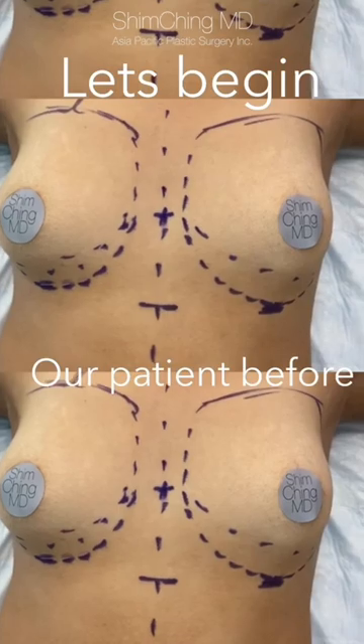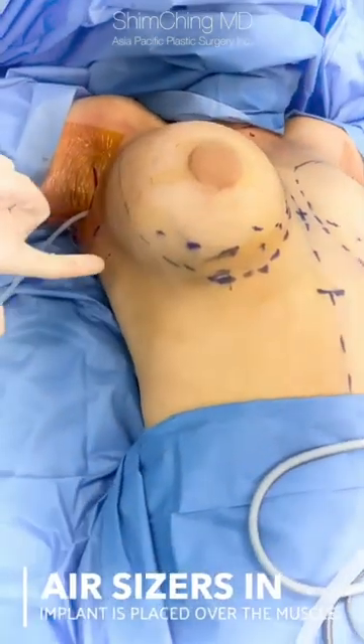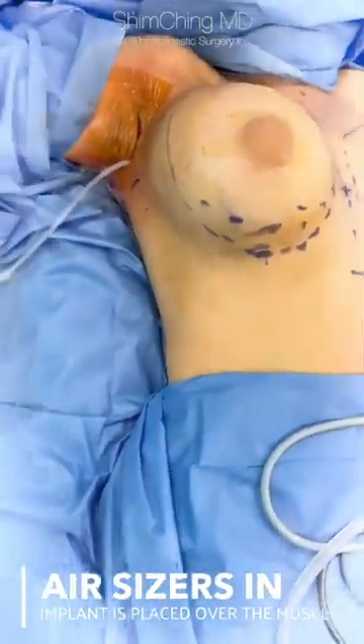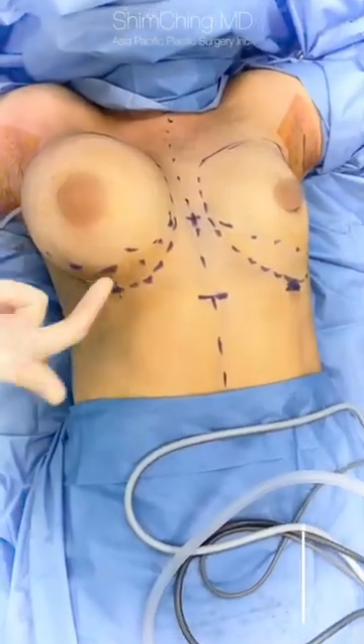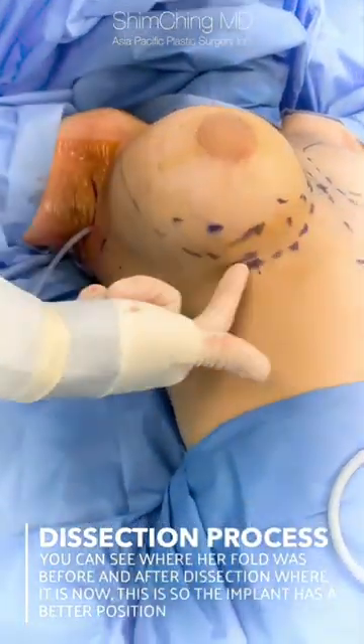The patient is getting a breast augmentation using an armpit incision approach, so she will have no scarring on her breasts. The implant is placed over the muscle. We are dropping the fold — you can see her old fold here and the new fold down here, where the breast meets the chest.